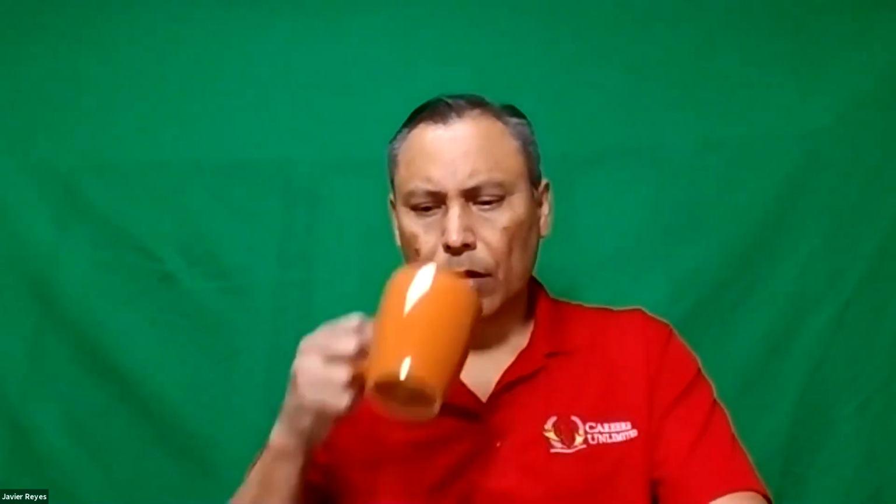This is step one. Every time we look at an EKG, if you don't even know what you're looking at, you start right here. Step one: determine if it's a sinus rhythm and determine the regularity. Are we ready to move on to step two, or do we have any questions here? Norma and Janie, do you have any questions? No questions? Okay, we're going to move on to step two.